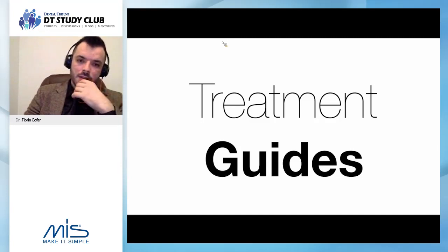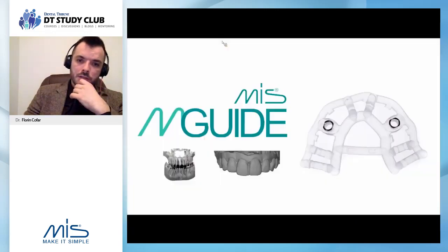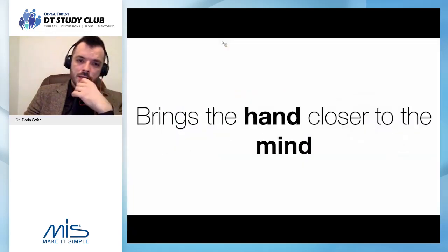Now the design is going to serve as a treatment guide for pretty much everything we need to do, from tissue reduction to surgical guides. Basically, if we talk about digital in general, what it does, and this is something I heard from a friend in South Korea and I liked a lot, the digital, what it really does, it brings the hand closer to the mind.